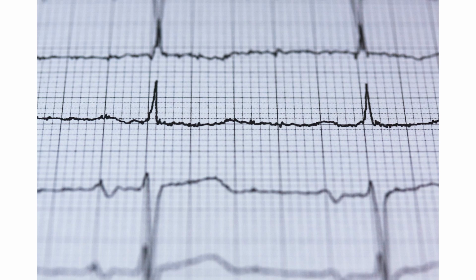Modern day electrocardiographs have digital acquisition of ECG data and print them even on usual printing paper. Many of the modern ECG machines also have diagnostic algorithms incorporated in them so that they give printed interpretations as well.